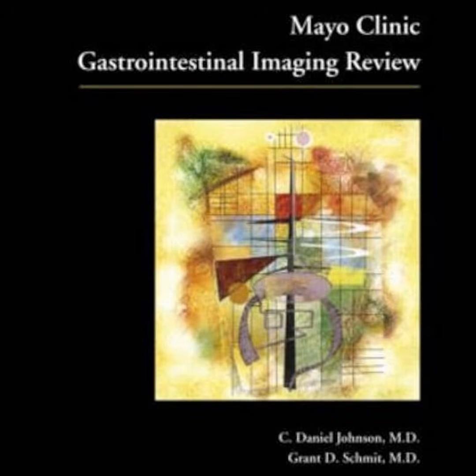Exactly. Because the colon has these very specific watershed areas. Right, border zones where the distal branches of two major arterial supplies meet up. And the splenic flexure is a classic watershed area. If a patient's global blood pressure drops, these end-of-the-line zones are the very first to starve of oxygen. The plumbing just can't get the flow there. So on a CT scan, you'll see a circumferentially thickened colonic wall localized specifically to that splenic flexure.